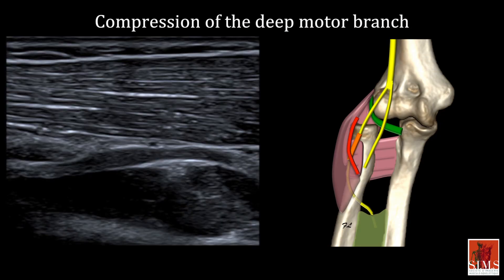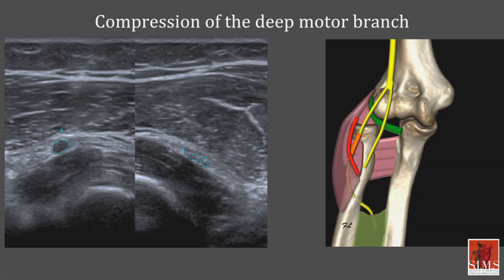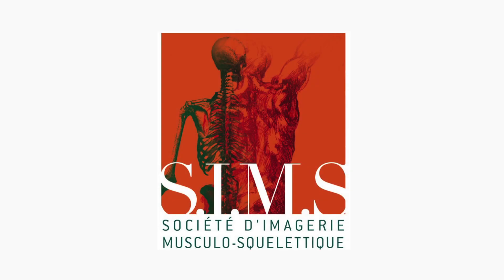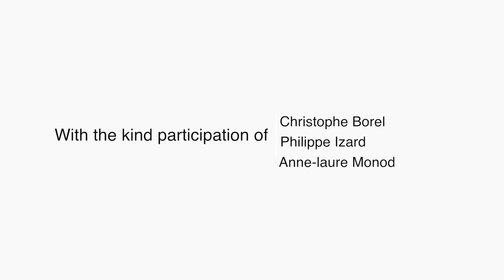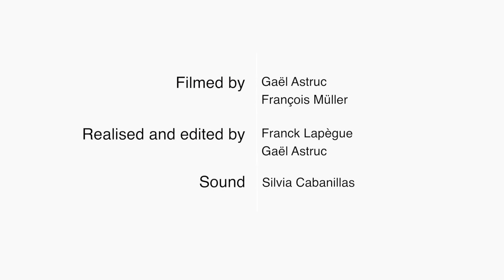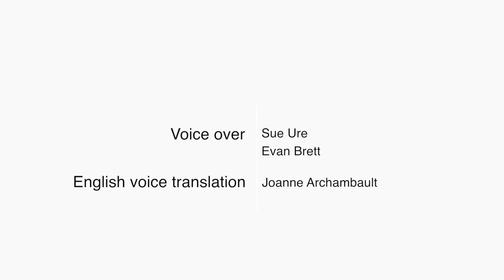Compression of the deep branch of the radial nerve is clearly seen here at the arcade of Froese. The ultrasound shows fusiform thickening, loss of fascicular appearance, and hypoechogenicity of the deep branch. This appearance was confirmed by comparing the sagittal and axial views.